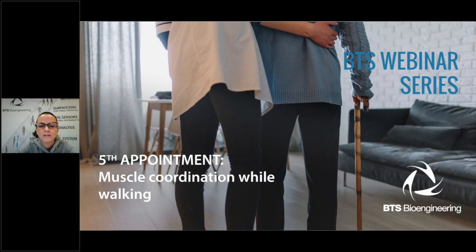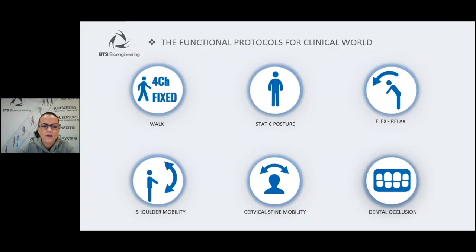Today, we will deepen the functional walk protocol dedicated to the study of walking. Also, the walk protocol, like all the other functional protocols presented during our previous meetings, is part of the evaluation package offered by the BTS analysis system, which allows the clinician to globally evaluate the patient in order to draw up his own functional diagnosis.